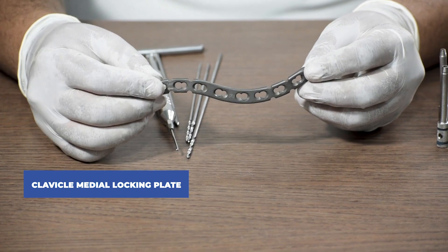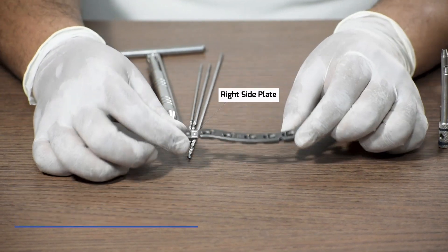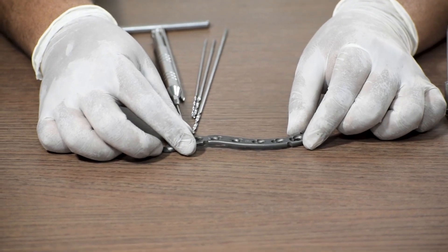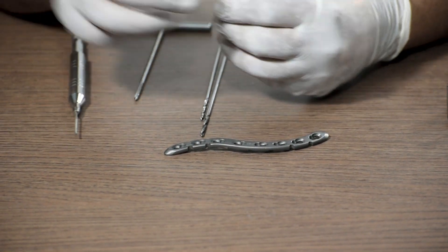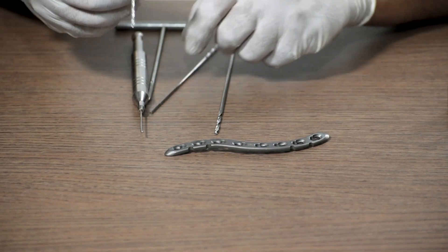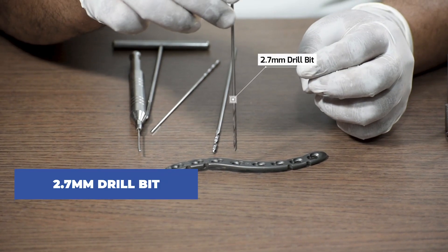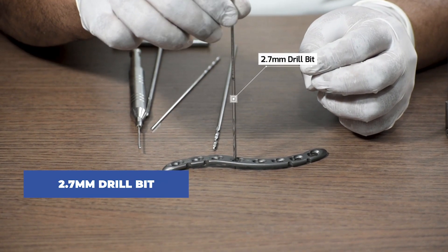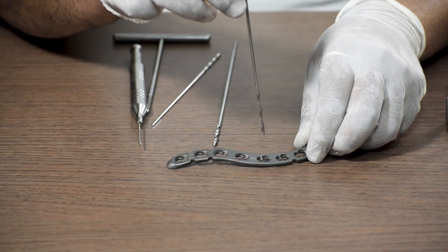We are going to use a right side plate for this demonstration. Once you have placed this plate in the fracture site, to start with we will fix this plate with a cortical screw — a 3.5 cortical screw. In order to do that we have to drill through the non-locking hole with a 2.7 mm drill bit. This is a non-locking hole, or a cortical hole.